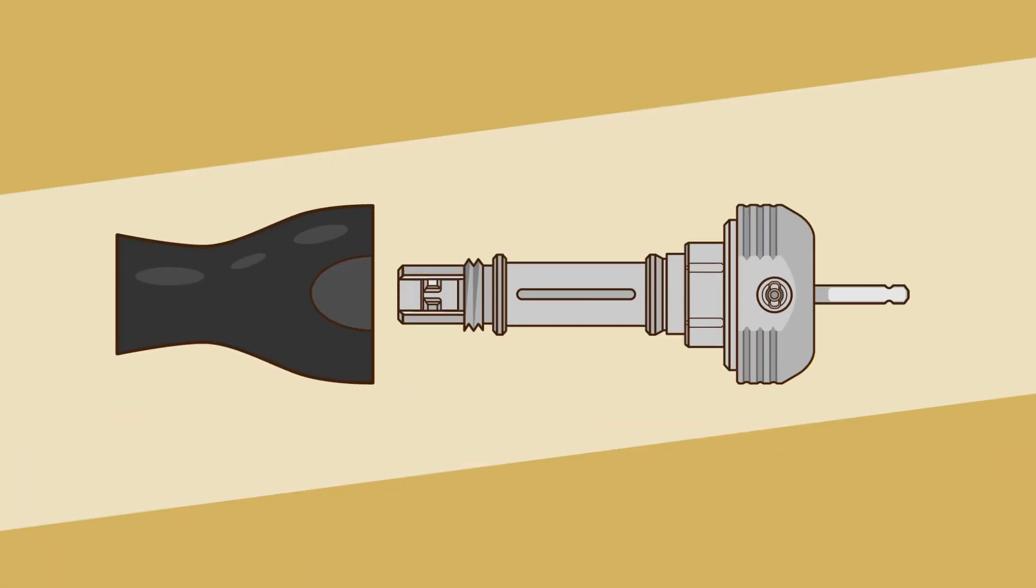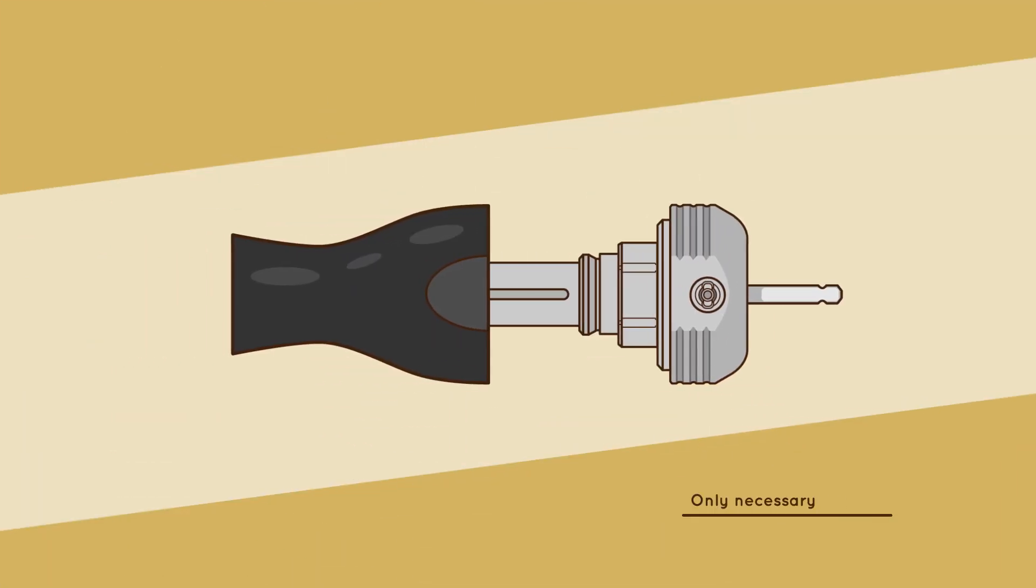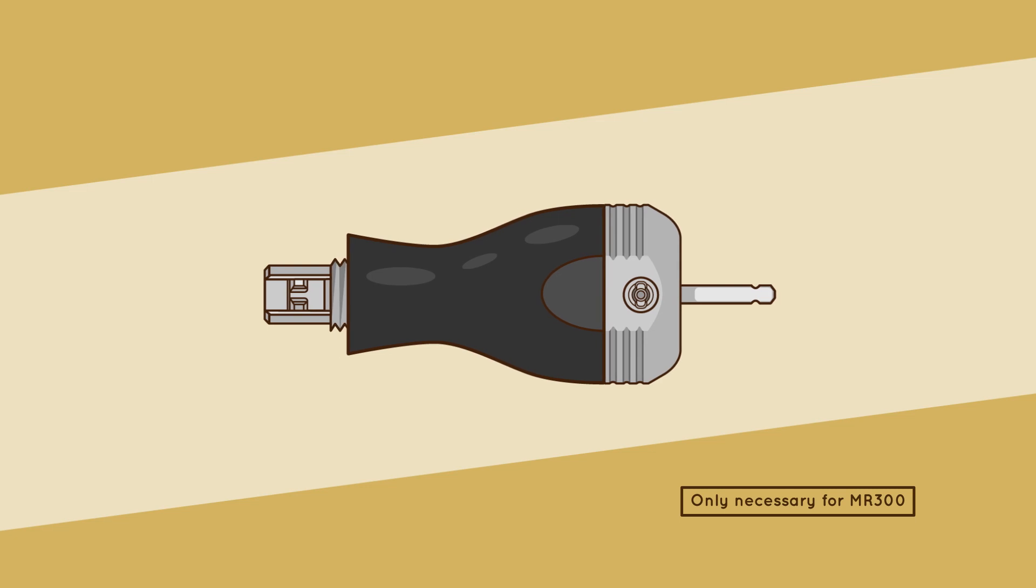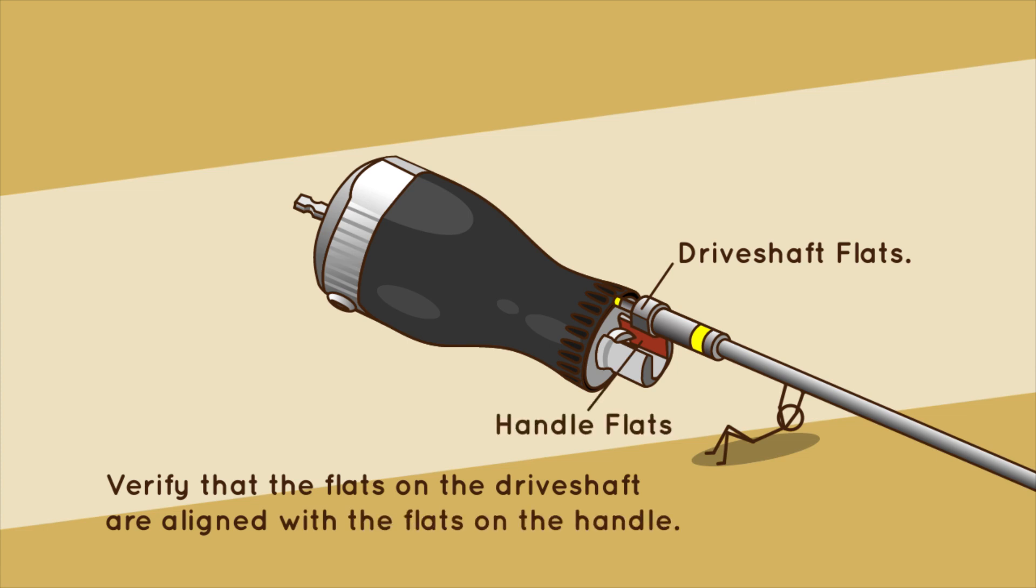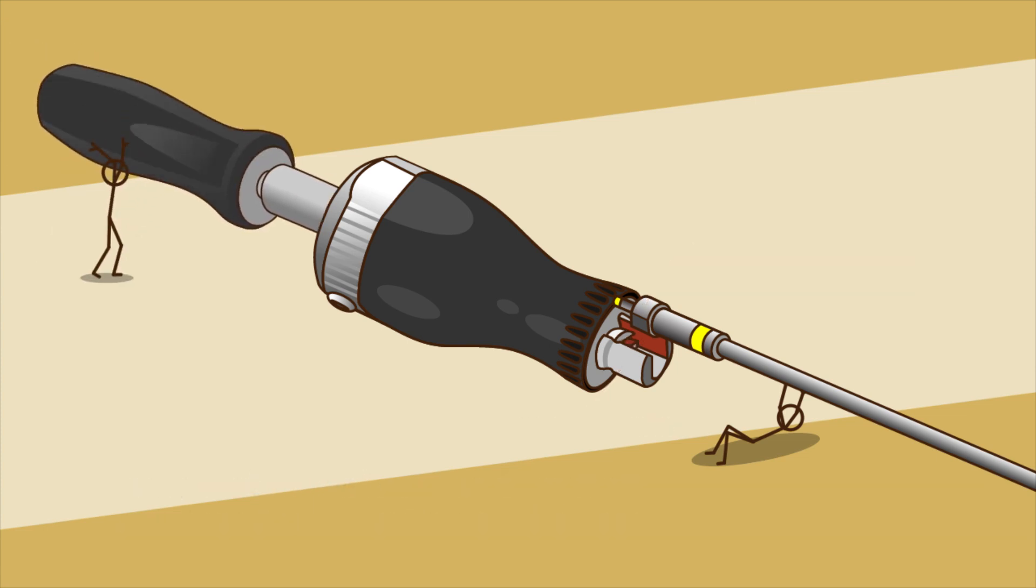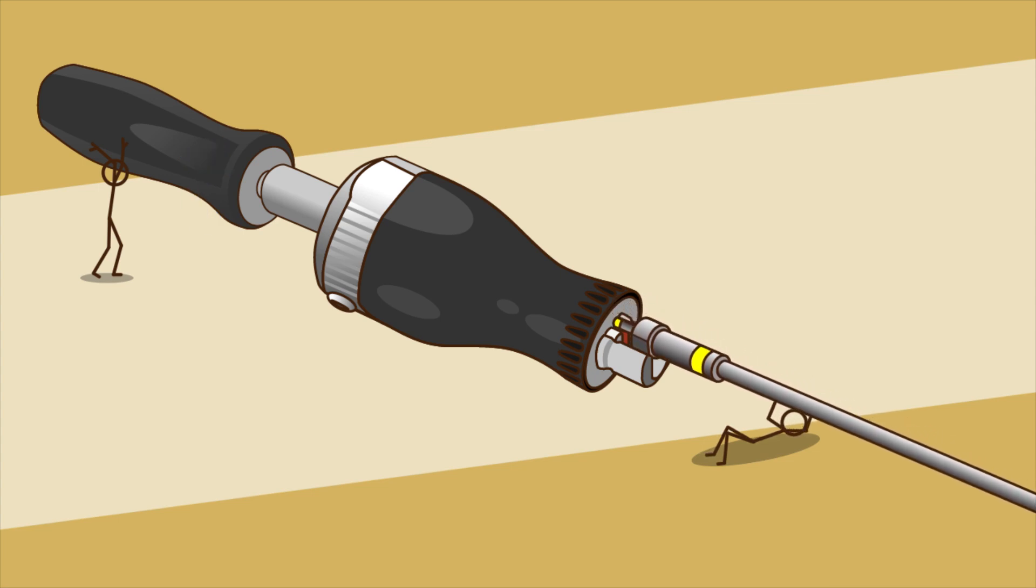Step 2. Slide the handle assembly onto the mechanical assembly until it bottoms out. Verify that the flats on the drive shaft are aligned with the flats on the handle. If not, use the torque handle to turn the drive shaft in a counter-clockwise direction until the flats line up.